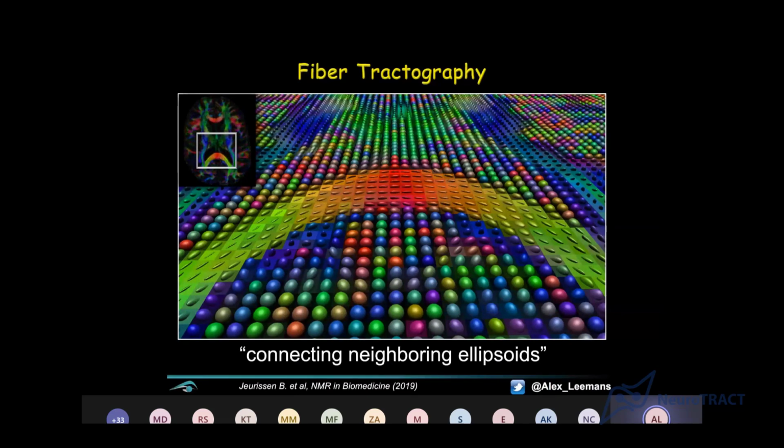All right, moving on. Obviously, tracts, tractography, fiber pathways. Well, we haven't seen any yet, right? But we've always been saying that with diffusion, you can probe this architecture. Well, if you look at, in this case, the splenium of the corpus callosum area, we see all these ellipsoids, and they're all pointing to each other, and our brain is already connecting all these discrete elements, right?